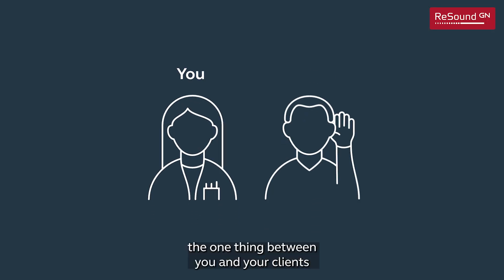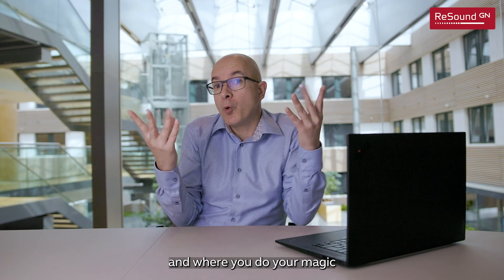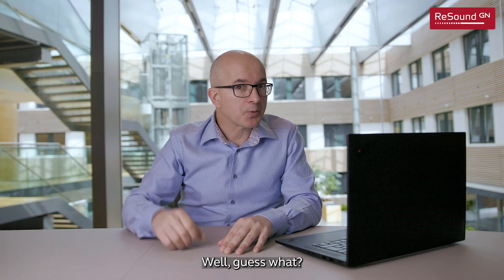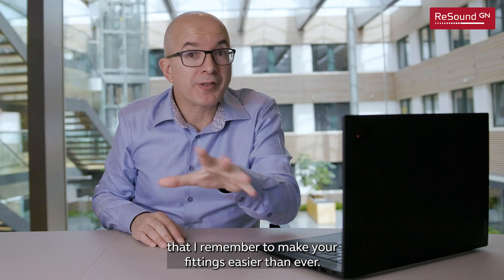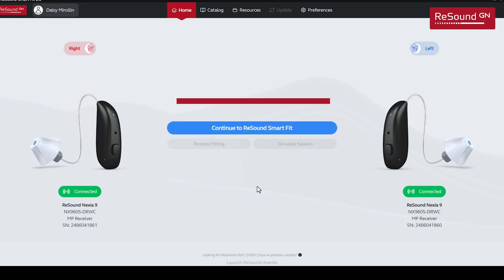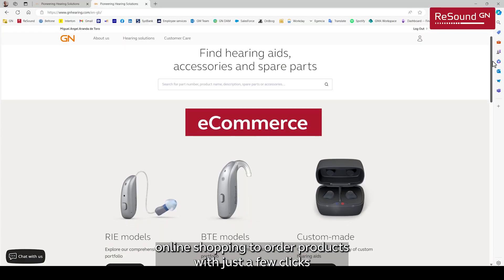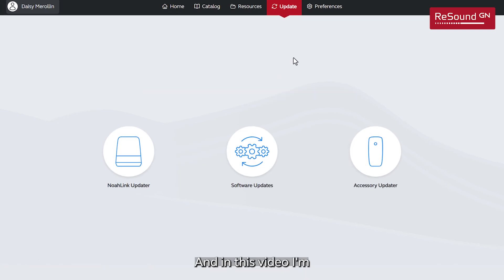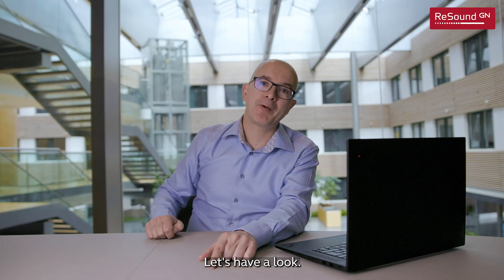The fitting software — the one thing between you and your clients when programming their hearing aids and where you do your magic to give every one of them their best possible hearing. Well, guess what? ReSound Smart Fit just got one of the biggest upgrades I can remember to make your fittings easier than ever. This is the new ReSound Smart Fit 2.0, now with a more intuitive look, online shopping to order products with just a few clicks, and new smart functions to speed up your workflow. In this video, I'm going to give you a quick introduction to get you started in no time.